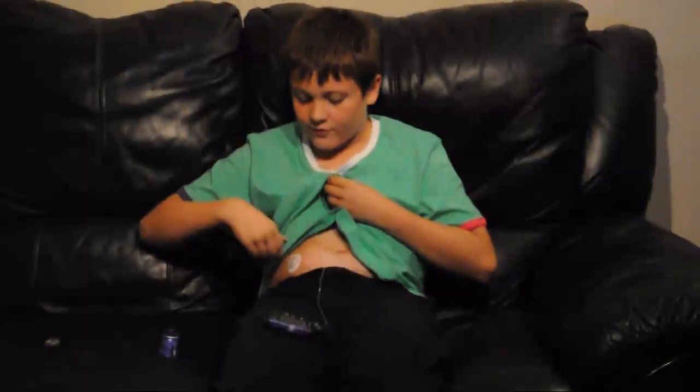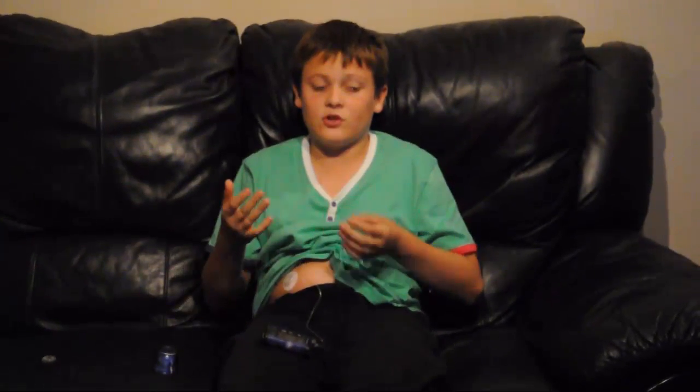I change the set every 3 days unless I have an accident, in case I knock it on a table or at the park or whatever I'm doing, in which case I need to change it again. It's really easy to change. It's not a lot of work. You can do it really easy there and then. It's not hard to do. Pretty simple. Can be done anywhere at any time.